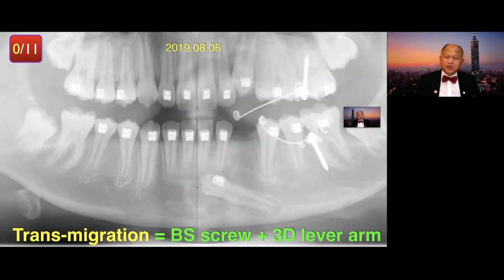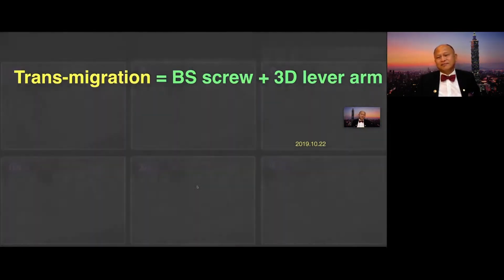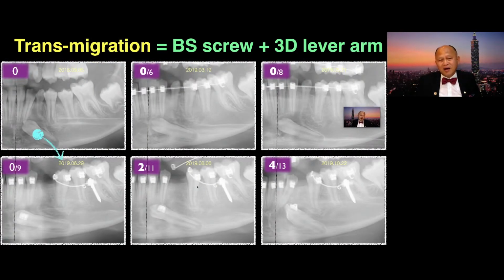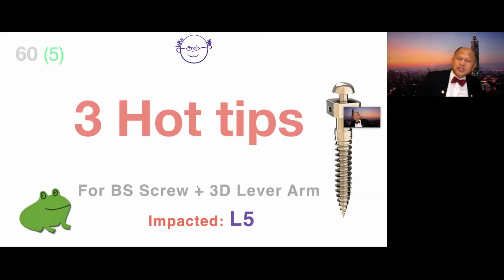We put the buccal shelf screw with 3D lever arm, and that's what we get. Wow, amazing result. Did you see that? Transmigration, buccal shelf screw, 3D lever, hard tip.